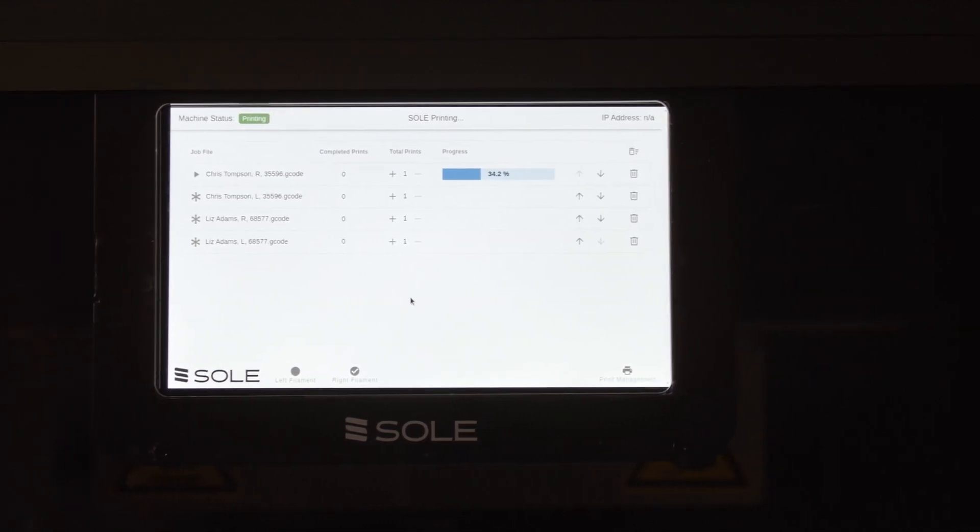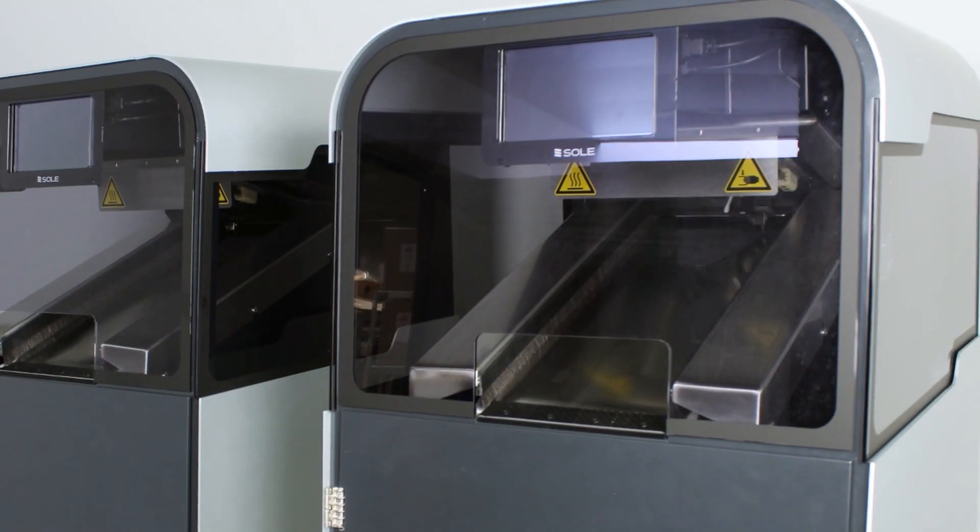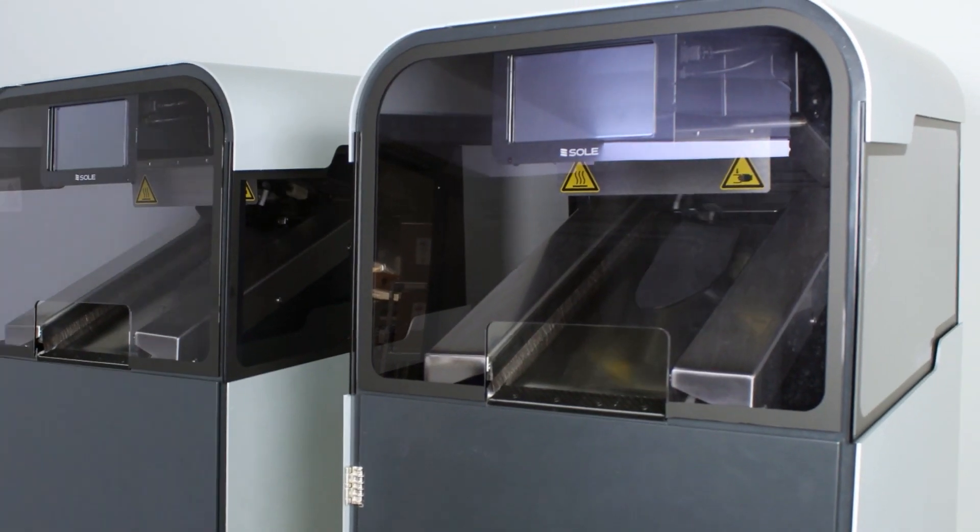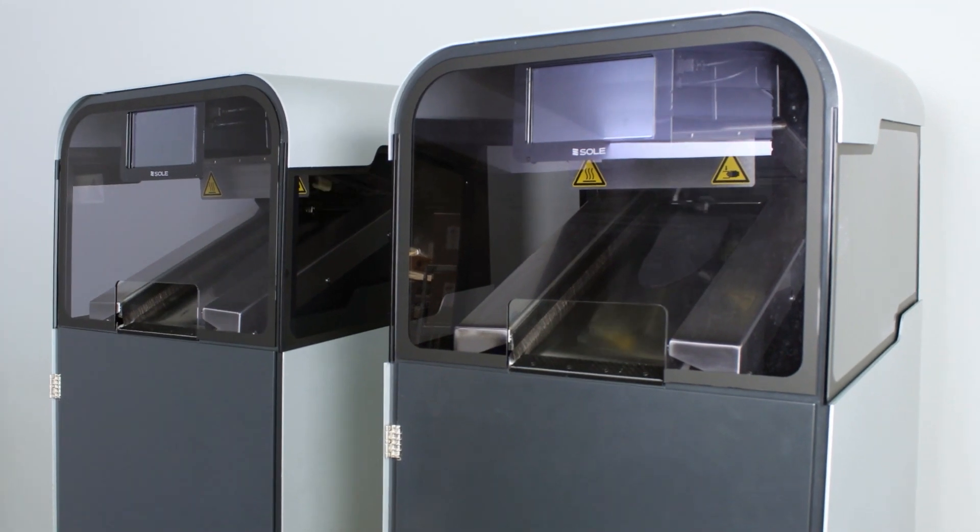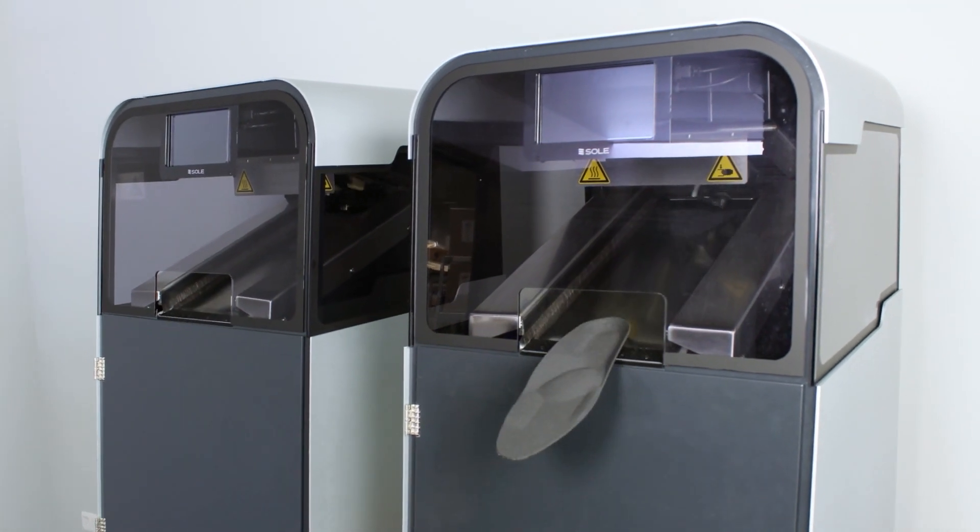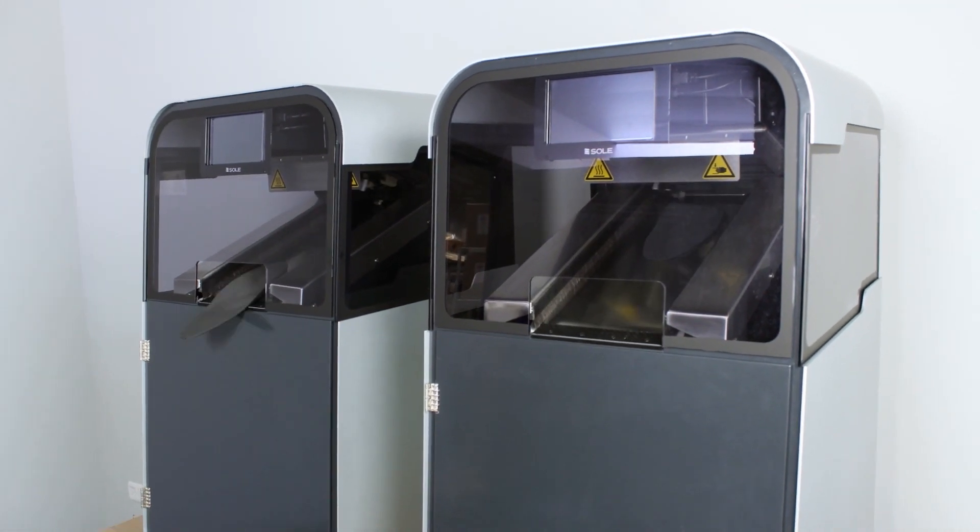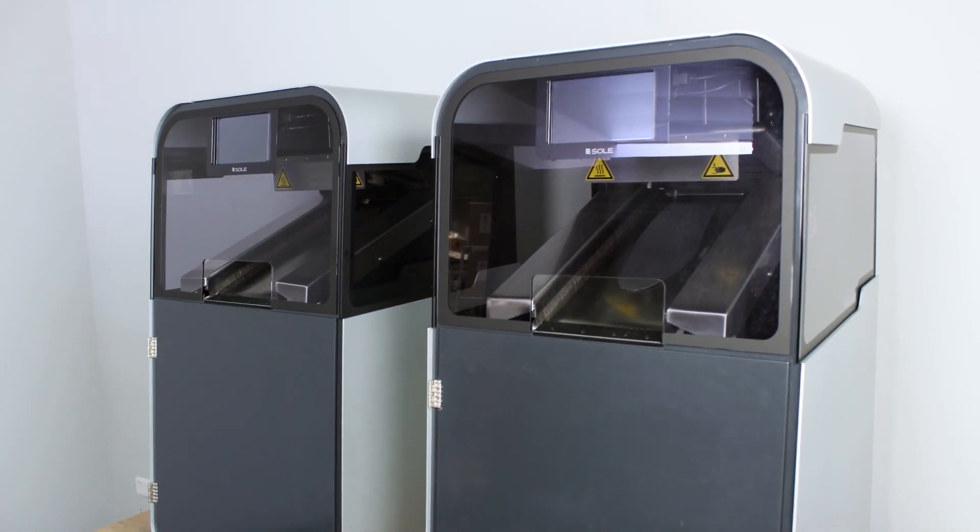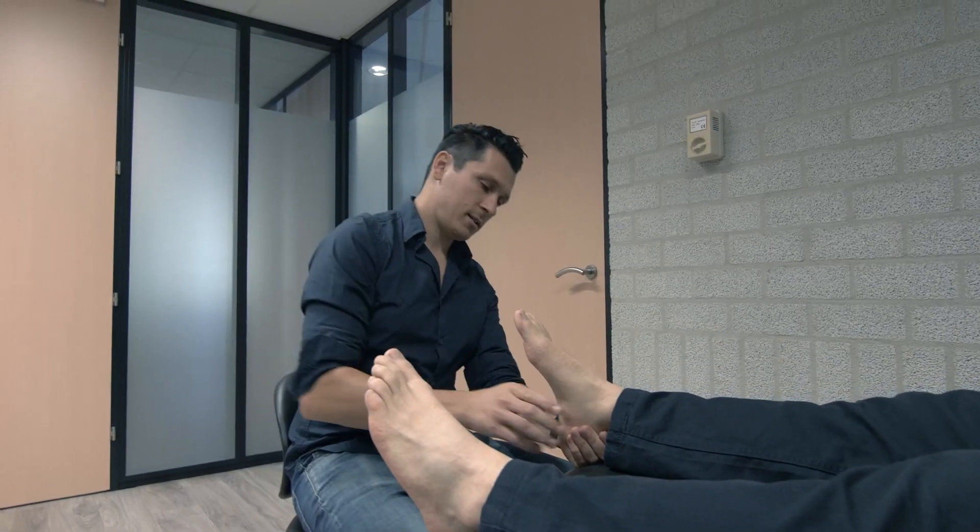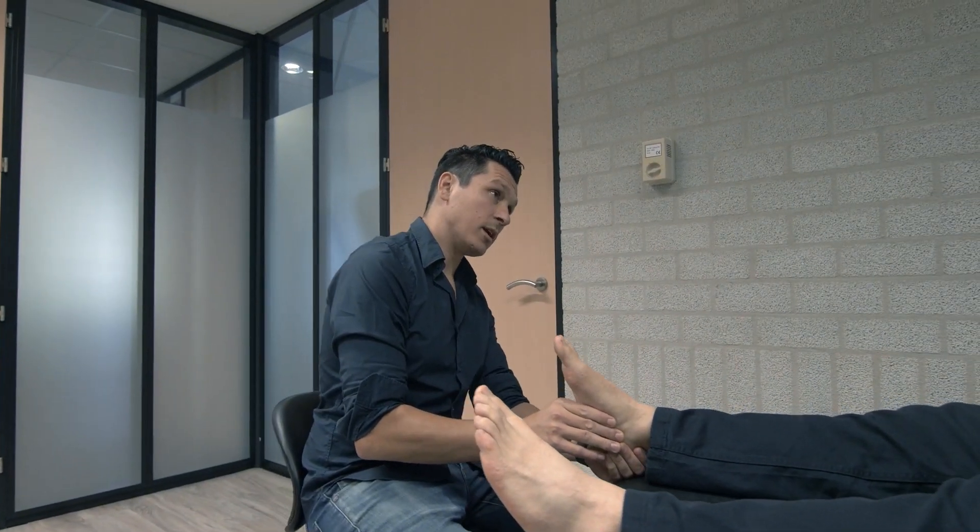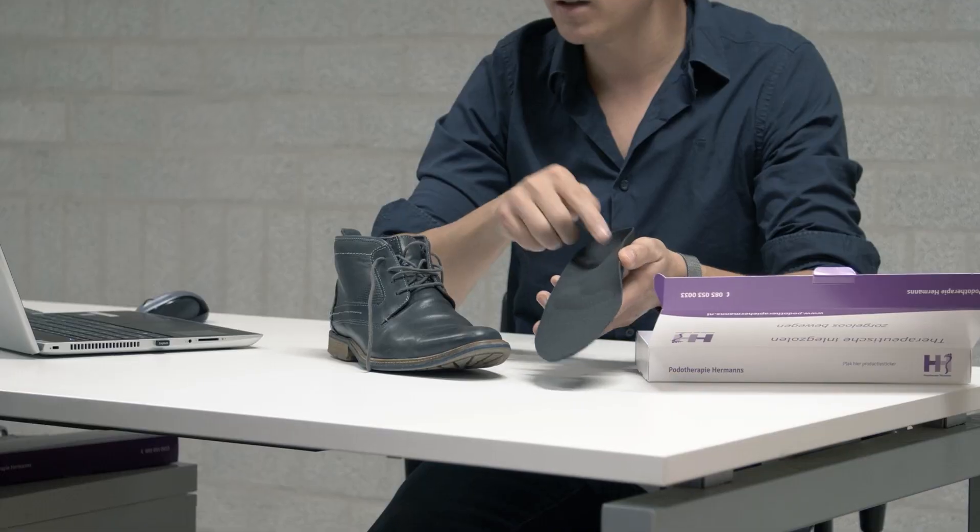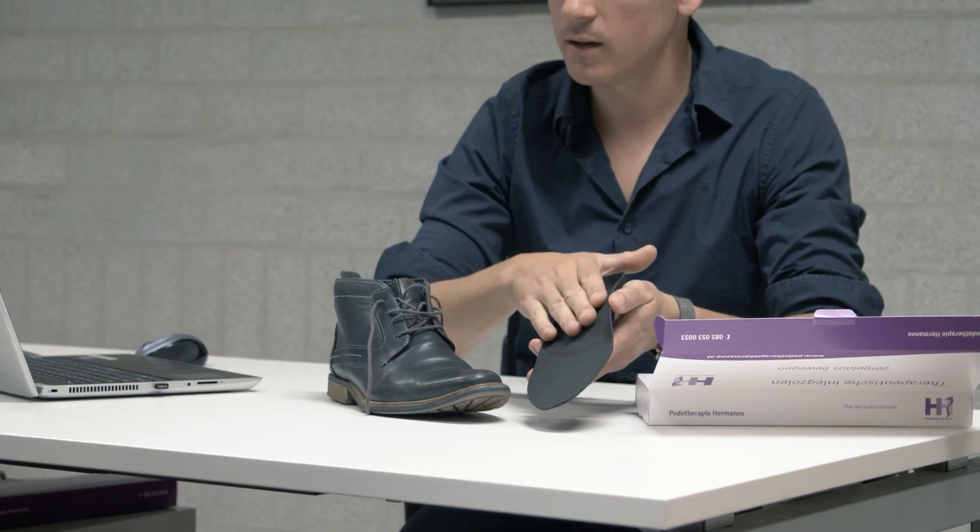Completed prints are ejected at the front of the machine. 3D printing has never been this easy. Our goal is to enable everyone to benefit from this breakthrough technology.